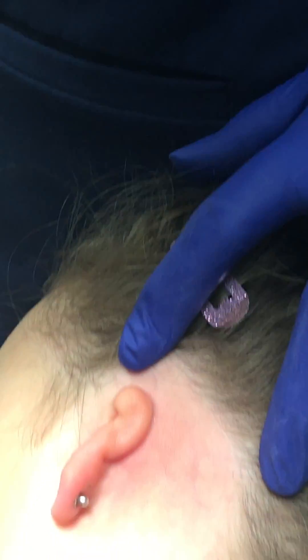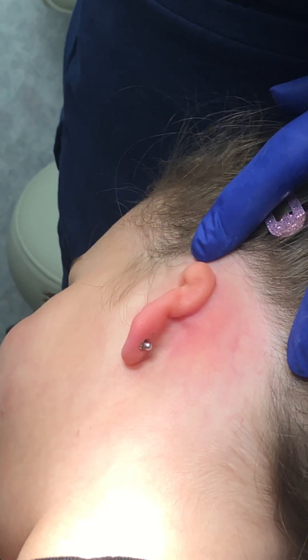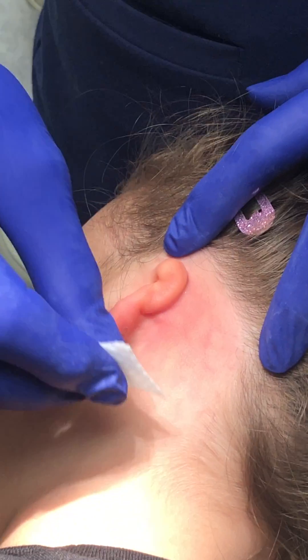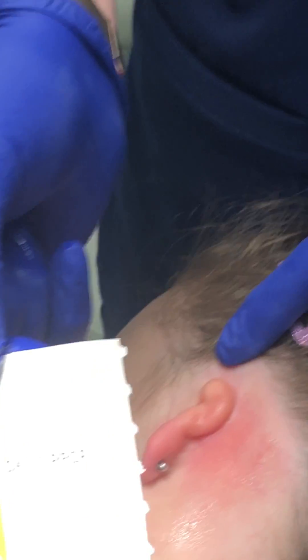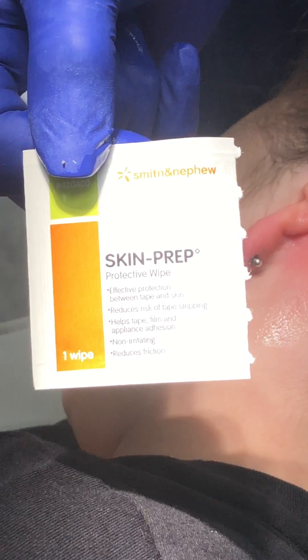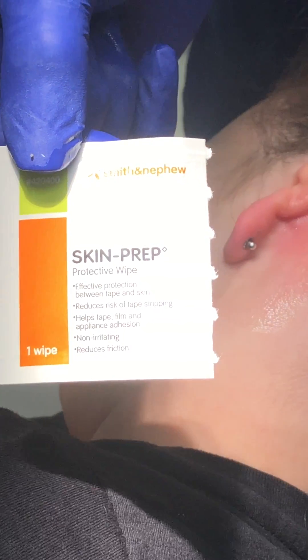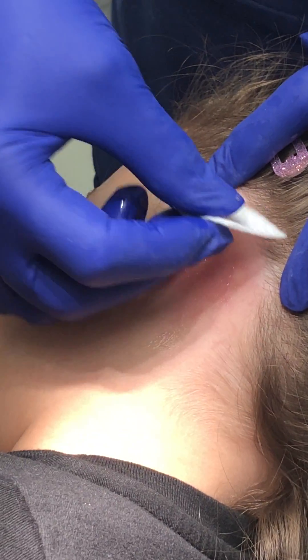So once we have the alcohol, we use the skin prep. Can I have an empty skin prep so we can show? This is skin prep — this is what it is. We use this to clean the skin also. It keeps it moisturized and it keeps it clean and oil free. It comes in a little square like this.